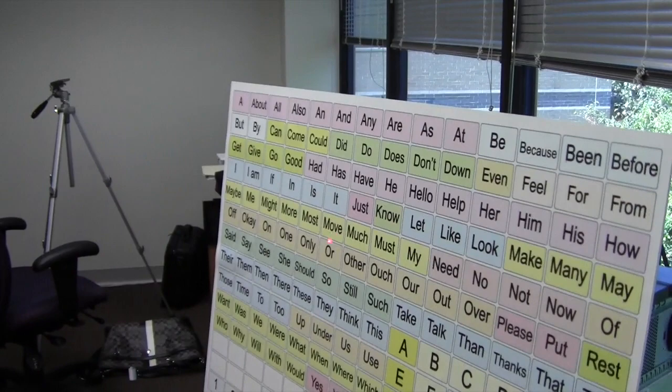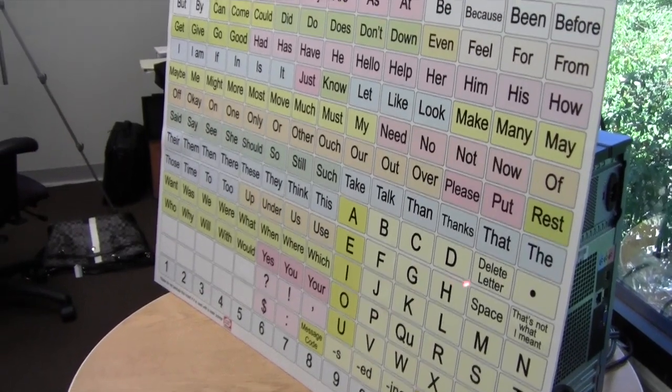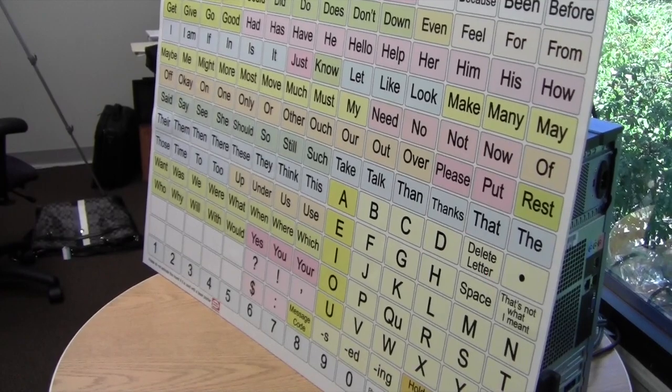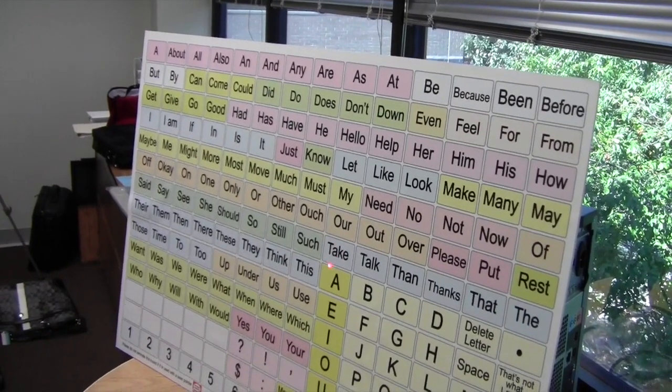I could say "my" and then "hand" — H — and move my hand, and I did that simply by putting the laser pointer on my hand.